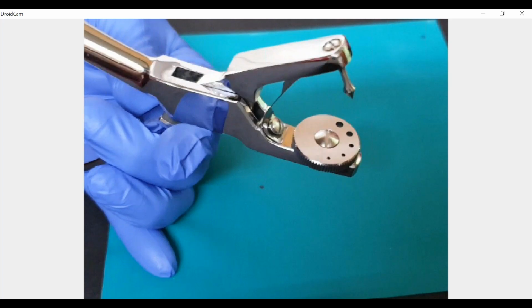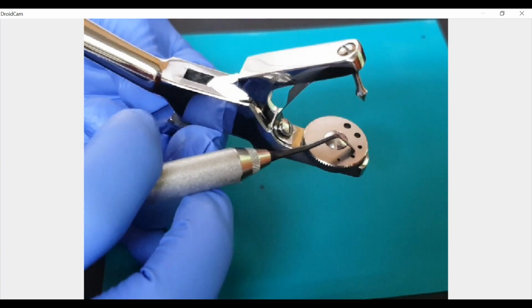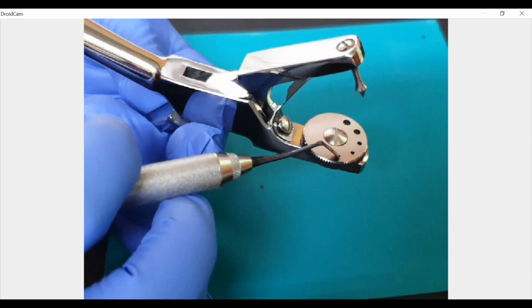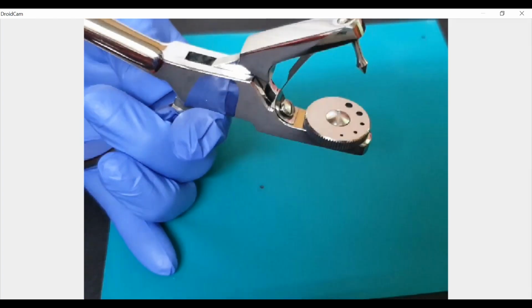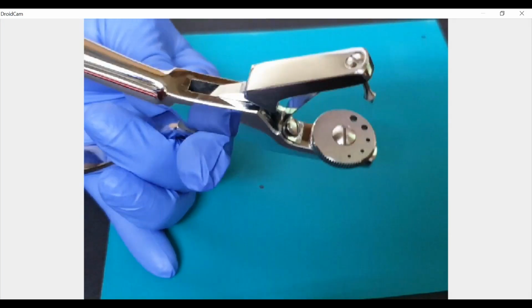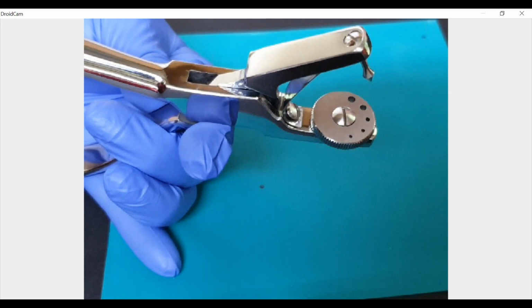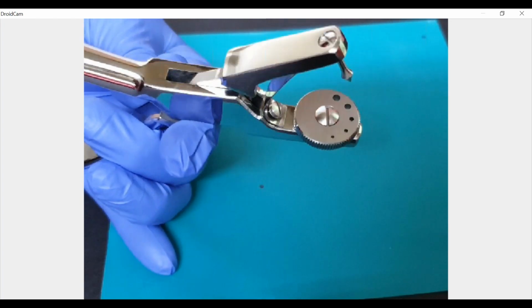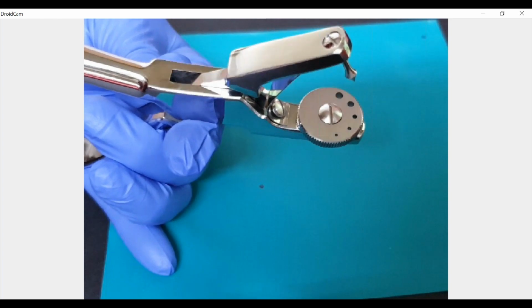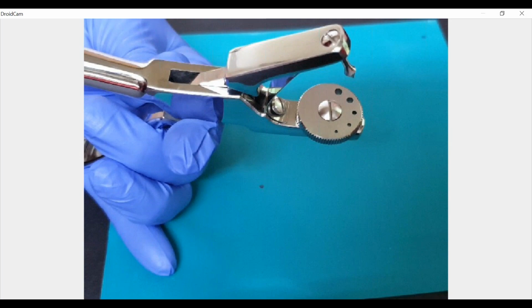I hope you have identified this, the third one, the one in the center. So we will not go beyond this for any of our isolations. Although they are indicated, it becomes a little difficult to mount it on your clamp if you have such tiny holes, as well as there will be a lot of problems even when you perform multi-teeth isolation. So there are many reasons why you should not go beyond the third.